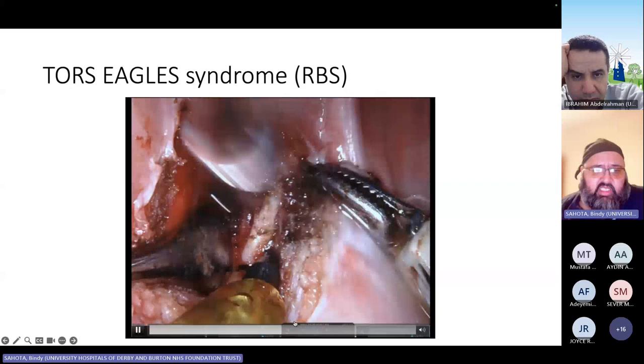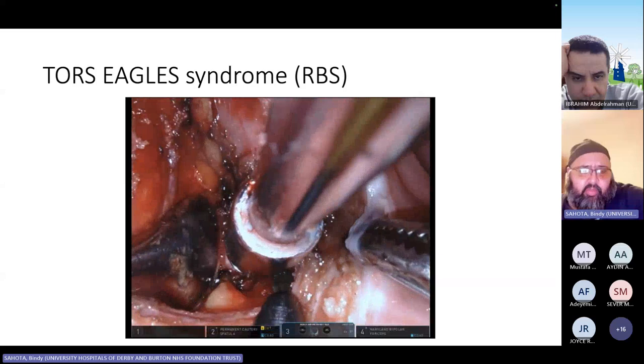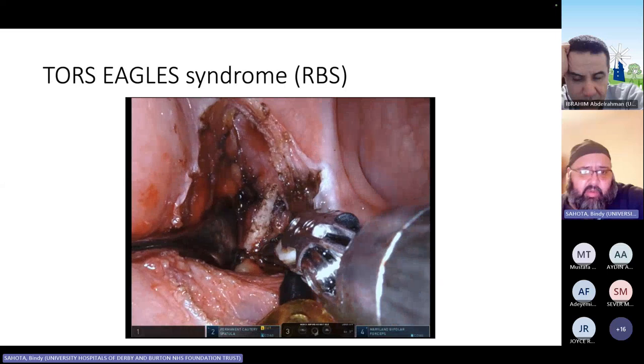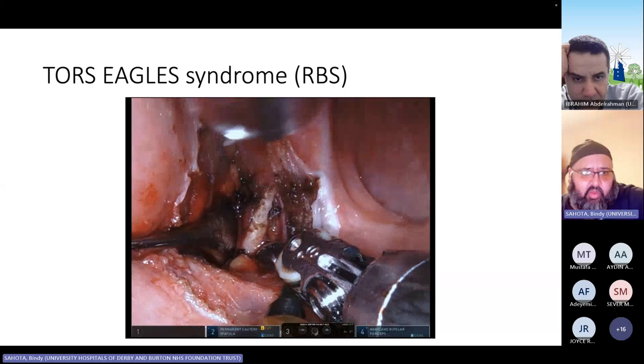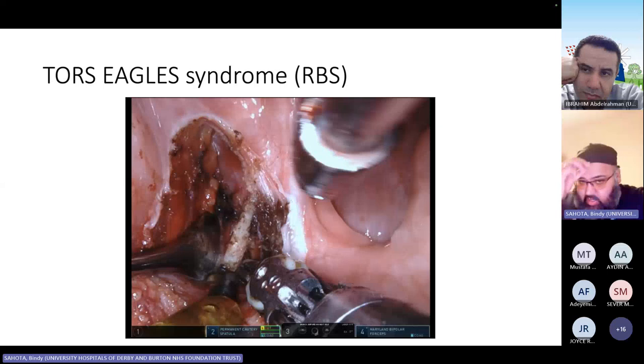Now, the thing about this is that, and you can see kind of how sharp it is and where it's sitting. Once you've got to this stage, the problem is you can't actually cut across it because it's so hard and bony. So what actually ends up happening is you delineate it up to the top until you're happy with how high you want to go up with it. Once you get up to the top of it, you then basically take out the robot and then you use a rongeurs and you basically cut straight across it because it's basically like a hard bone. And then you just take it out as a singular piece.